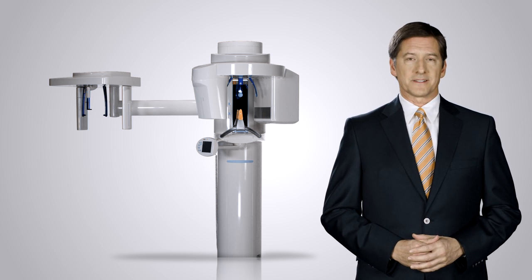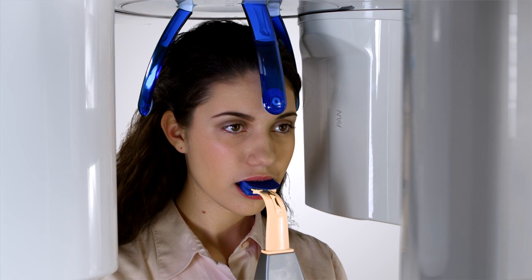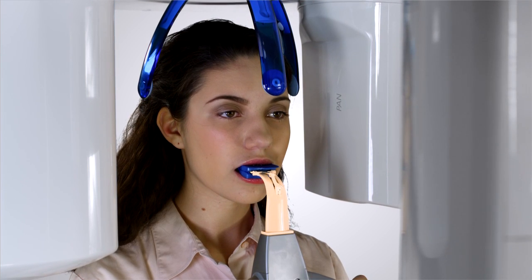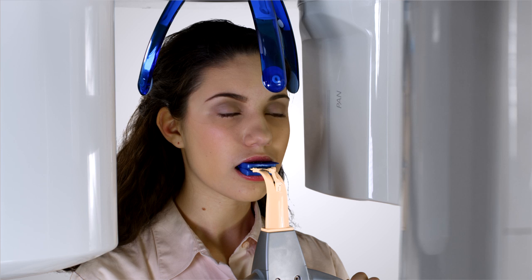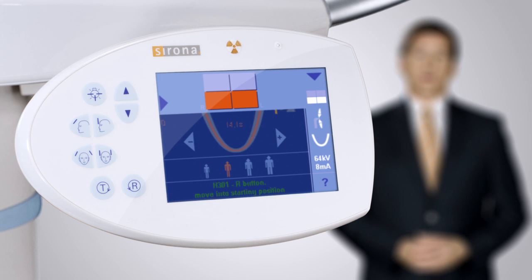Sirona has simplified patient positioning for panoramic imaging with the Orthophos XG auto positioner. With guided vertical adjustment, the operator moves the unit up or down to tilt the patient's head to the correct occlusal angle. The auto positioner assists the operator with taking images with confidence. Quadrant selection on the XG3D allows the operator to image the region of interest as prescribed by the dentist.